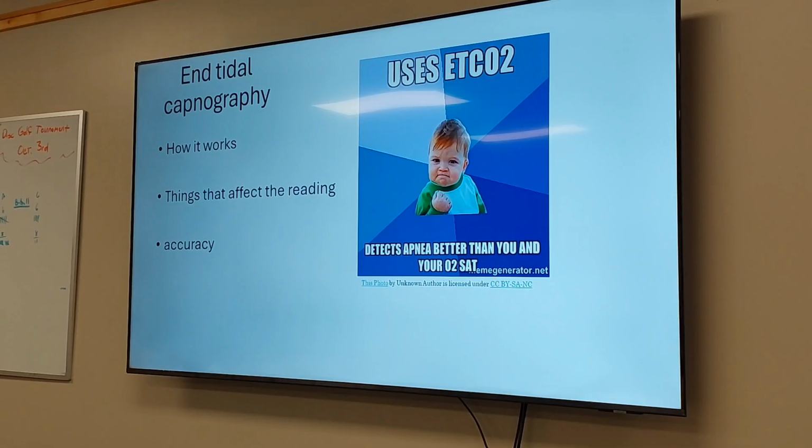End tidal works by measuring the concentration of carbon dioxide in exhaled air. So it provides real-time information about their ventilatory status. I wrote down in here about the phases, but I'm not going to go over that because it's a lot of explanation that probably isn't going to mean a whole lot to some of you.